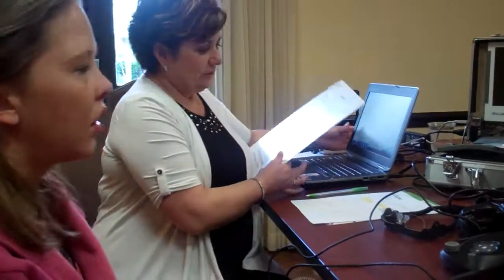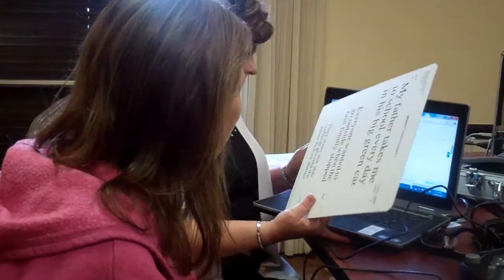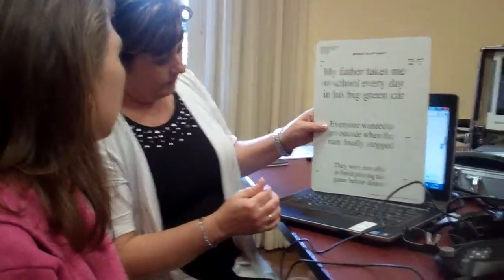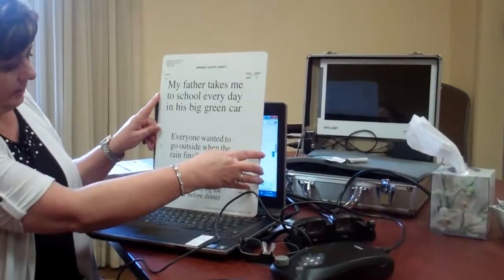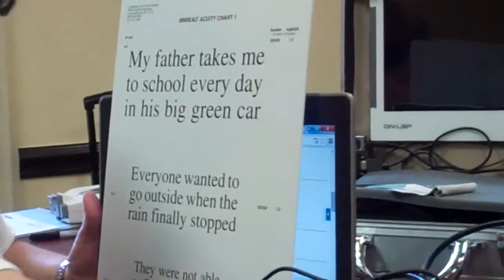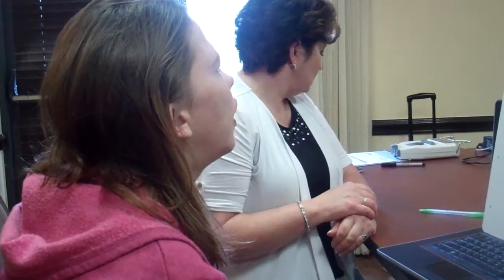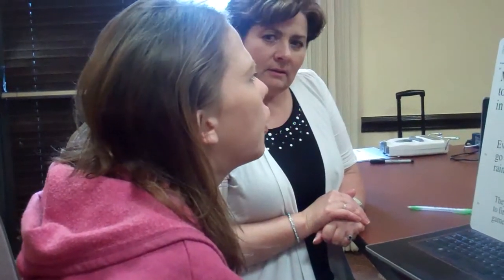Good for you. So now what I'd like to do is use this as a stand, if you don't mind. I'm just going to put a reading card up here. Now I'd like you about 12 to 18 inches away. Thank you. Are you able to make out anything on that top line? I think it's: my father takes me to school every day in his big green car.